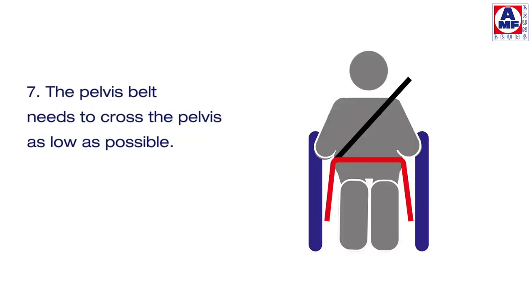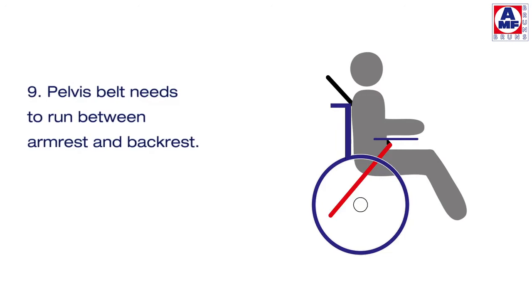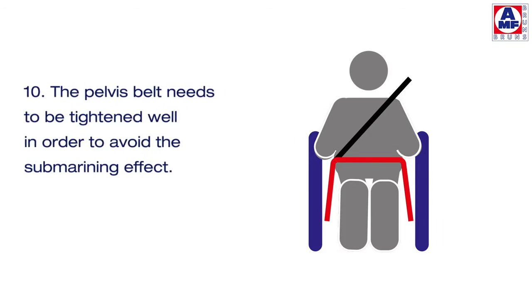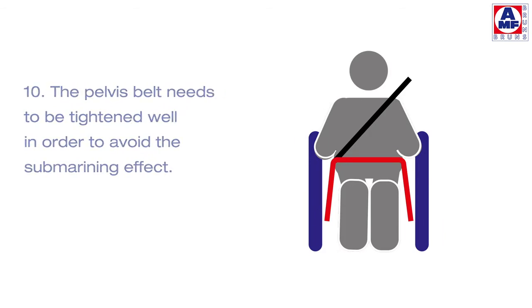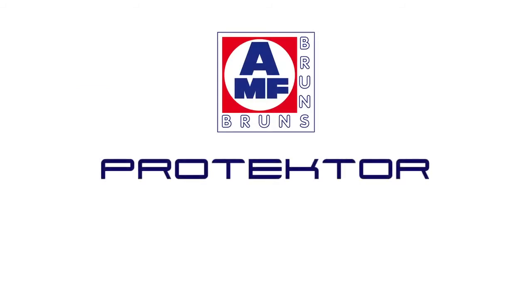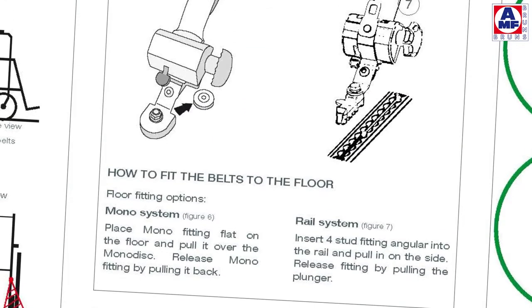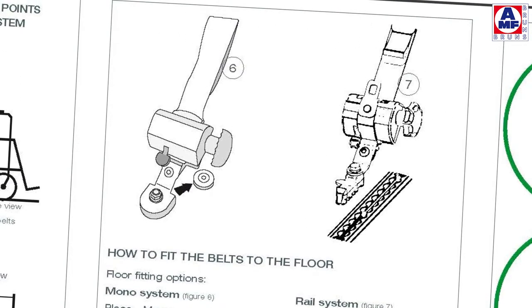The pelvis belt needs to cross the pelvis as low as possible and should have the maximum angle to the horizontal as possible. It needs to run between the arm rest and back rest, and must be tightened well in order to avoid the submarining effect. The shoulder belt should cross the shoulder right in the centre.